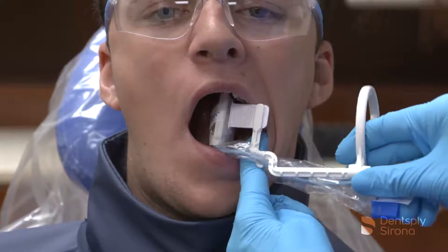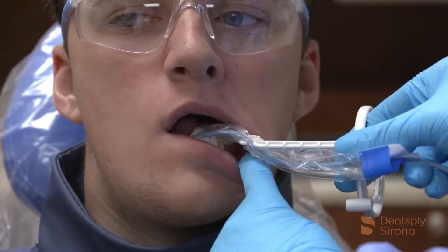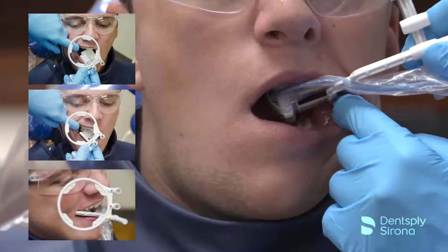Place the holder in the center of the patient's mouth to maximize patient comfort during the procedure. If the patient has a shallow palate, use a cotton roll under the bite piece to aid in patient comfort.